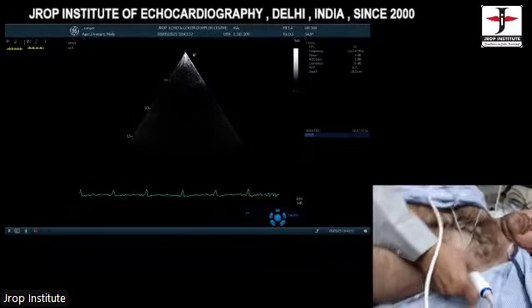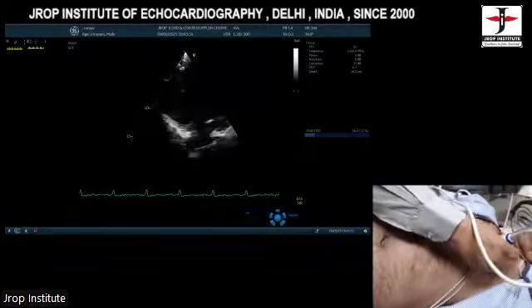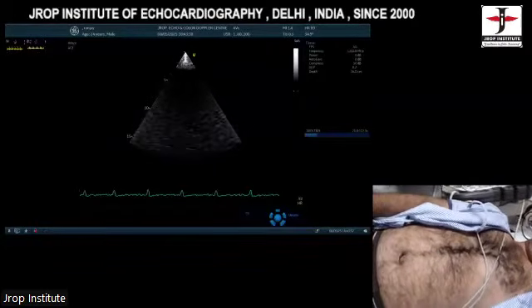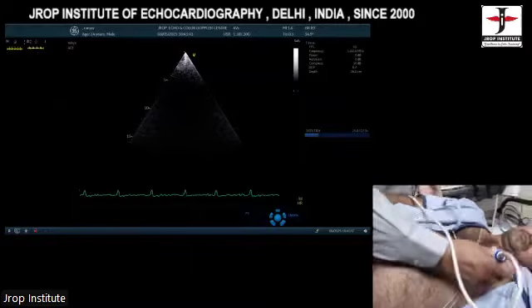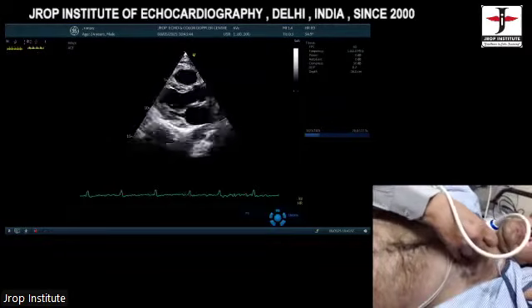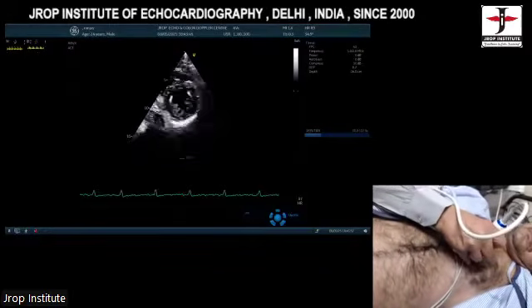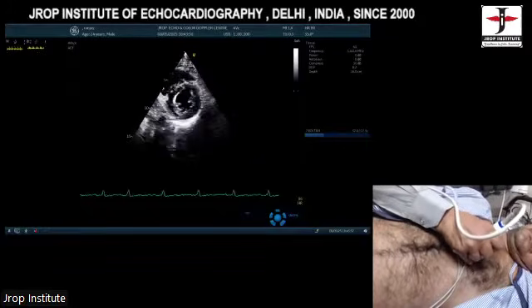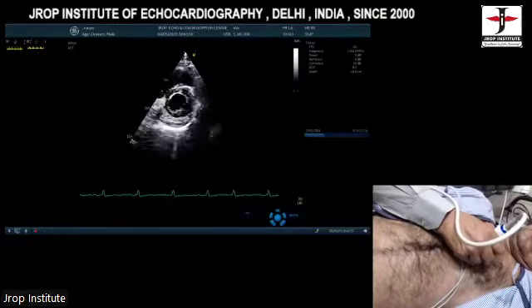Next comes mitral area by planimetry. So we go to the same point, Parasternal window. In the parasternal window, we make a parasternal short axis view at the aorta. Rotate, go to the papillary muscles, and gradually come back towards the mitral valve.